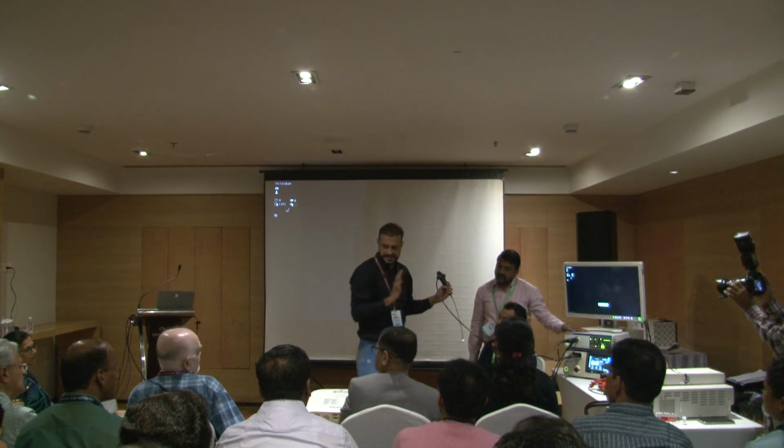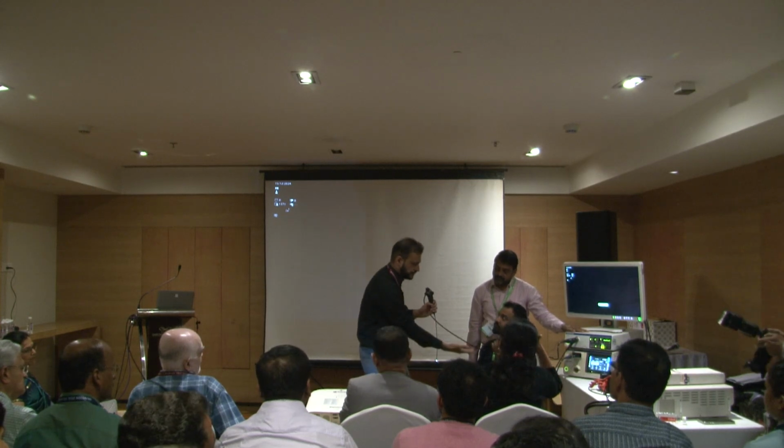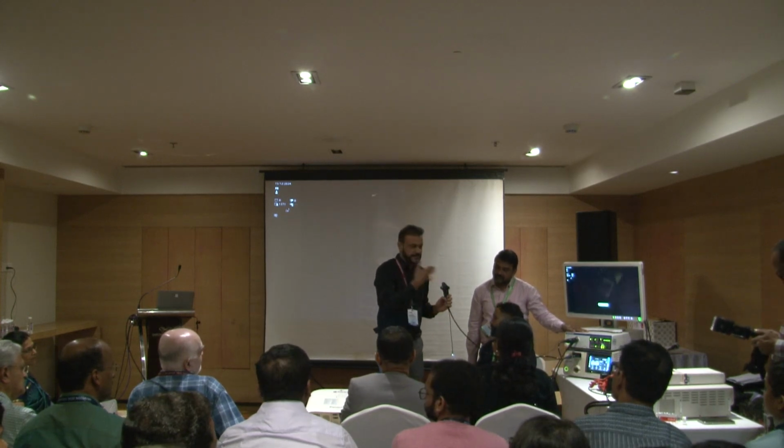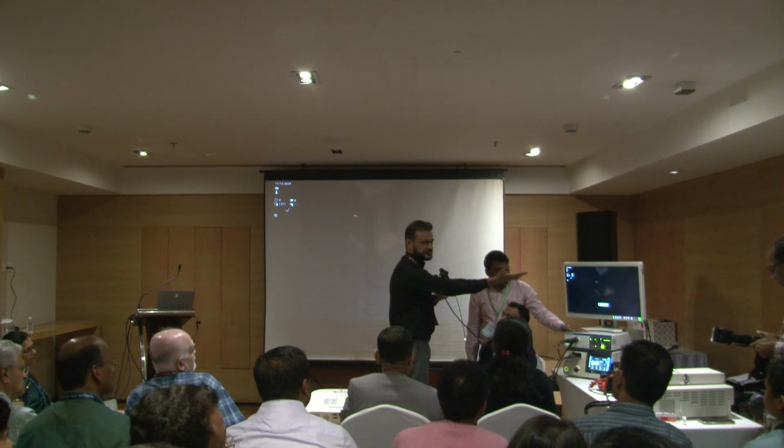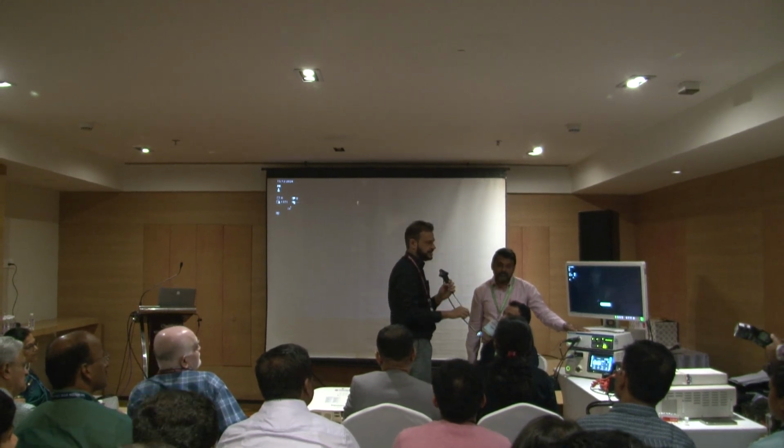Most of the time, yes, it is in standing position, and generally I would like to have the patient slightly higher, at my chin level. That will give you a better idea. And the monitor should be on the left of the patient. Generally, it gives a good view of the area.